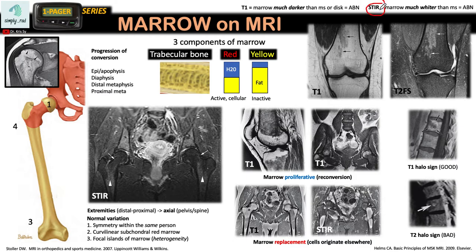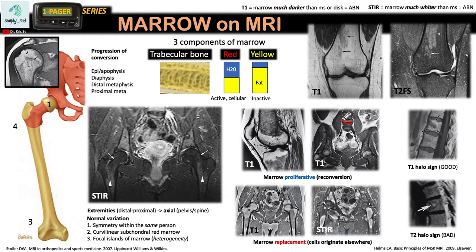On T1 non-fat-sat, look out for marrow that is much darker than the adjacent muscle — that is abnormal. In this example, the marrow within this vertebra has a signal much darker than the adjacent disc, meaning it has lost its fatty component within the red marrow. In this case the patient had a marrow proliferative disorder — a reconversion of fat into red marrow due to the body's increased need.